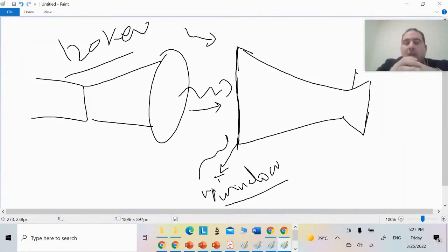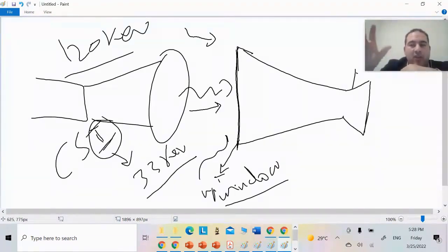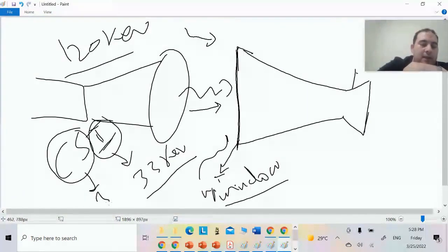For example, I shouldn't choose a material with a K edge that is significantly different from the energy range I am working in. It needs to be close. So they told you that you have cesium iodide. As we mentioned before, 33 kilo electron volts means that the nearby range will cause significant attenuation, and cesium is at approximately 36 kilo electron volts.